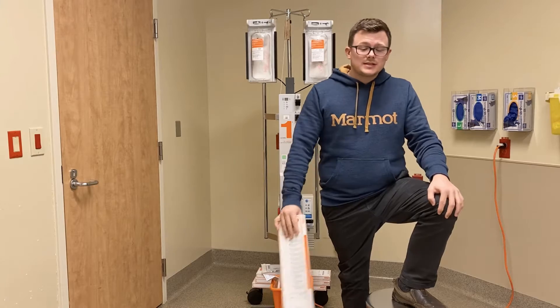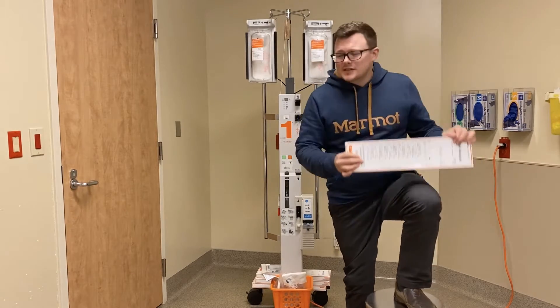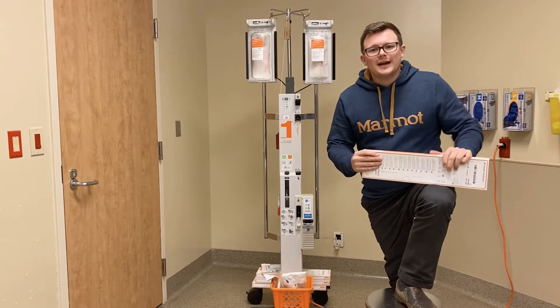Hi, my name is Chris. I'm a trauma nurse at an emergency department and today we're going to go over something that causes a lot of anxiety for people: the Level 1 rapid infuser and how to prime it.